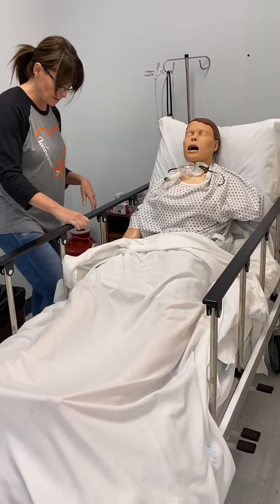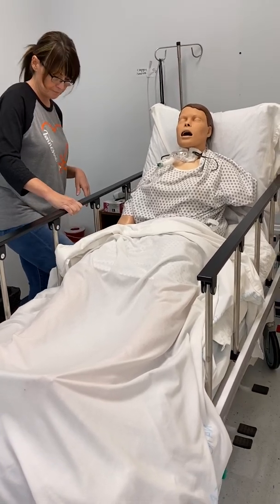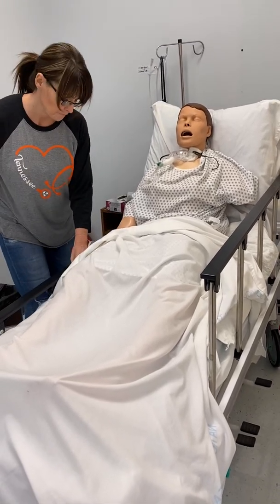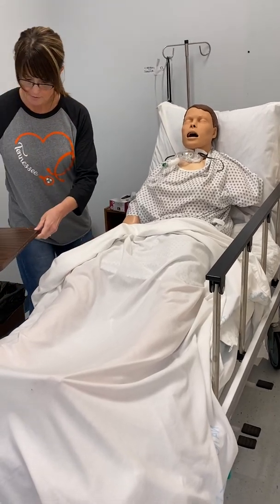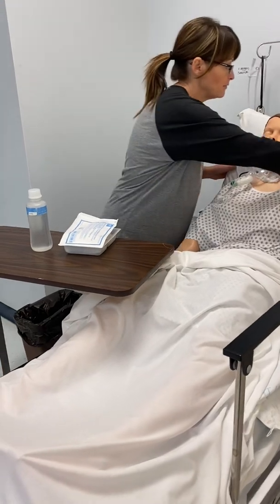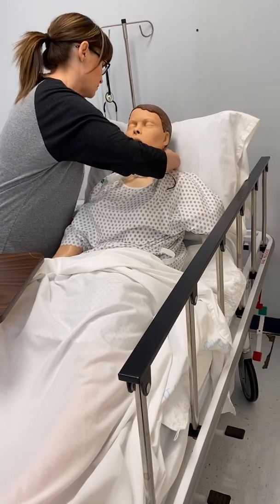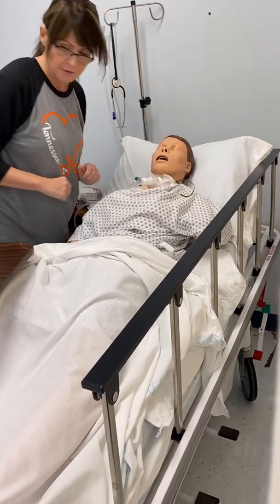I'm going to pick your bed up some, without catching your arm in it. I'm going to put my table up close to me. Do you have any questions before we get started? Okay, well, I'm going to lay your head back to make it easier for us. Okay.